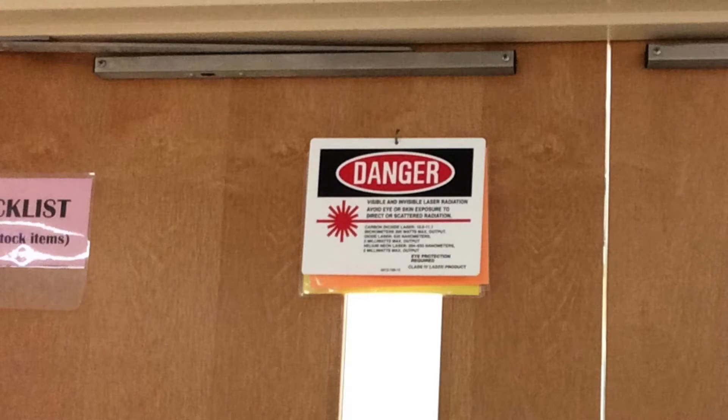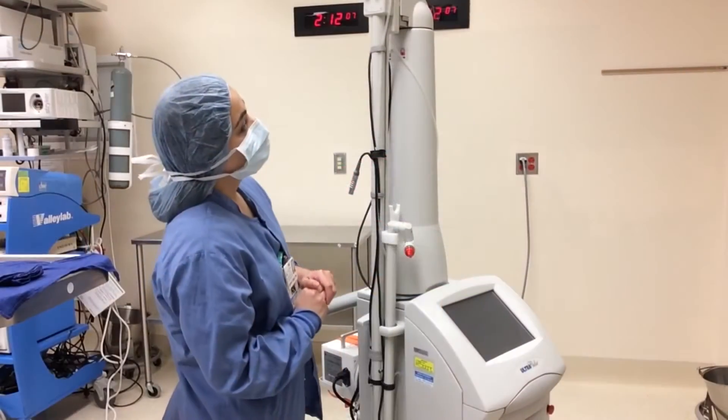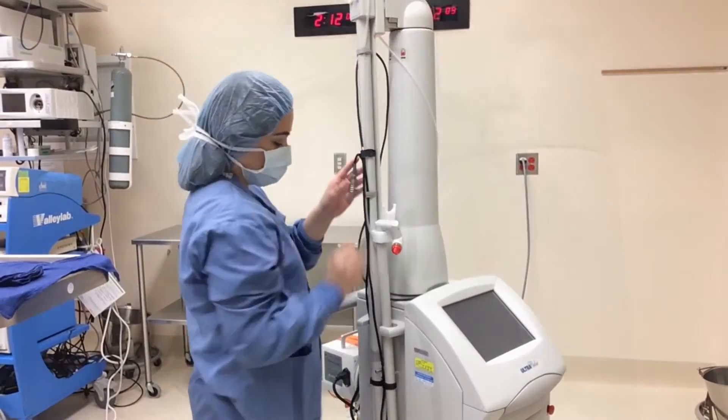The CO2 laser should be test fired before every procedure to ensure it is in working order. Before starting, place a laser sign on each entrance into the surgical suite. After you plug in the laser, you are ready to get started.